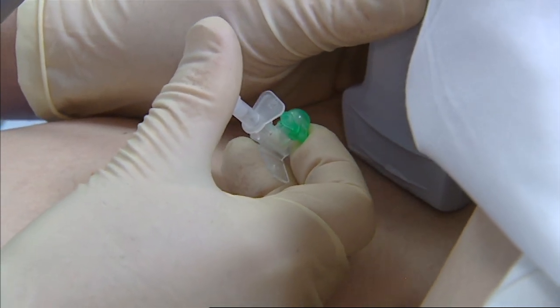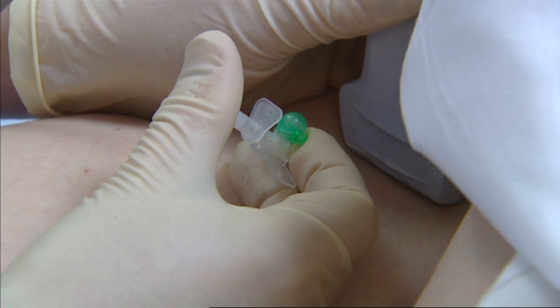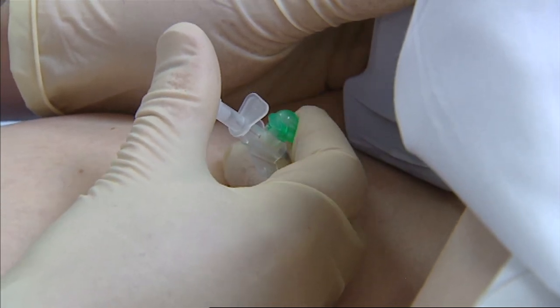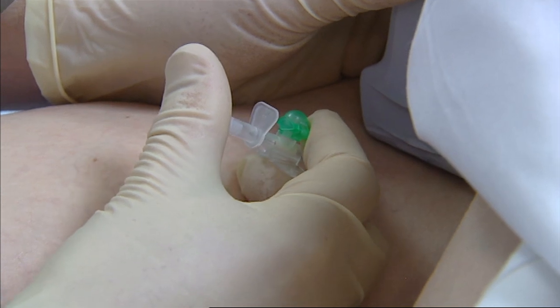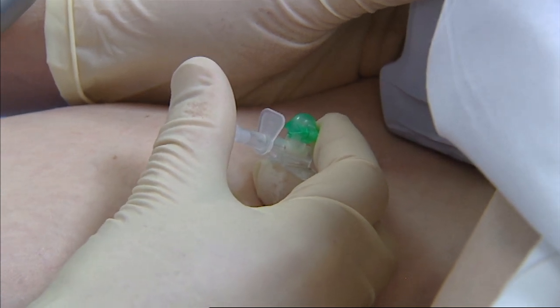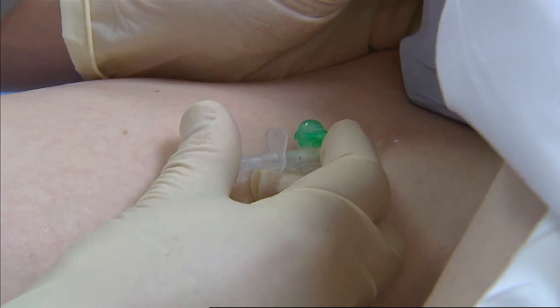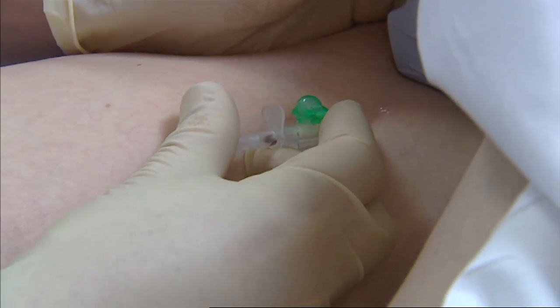Then we introduce a cannula of appropriate size. For the larger, deeper veins we use 18-gauge cannulas, and for the very small, superficial ones, 22-gauge cannulas. We just guide the tip of the needle into the vein.